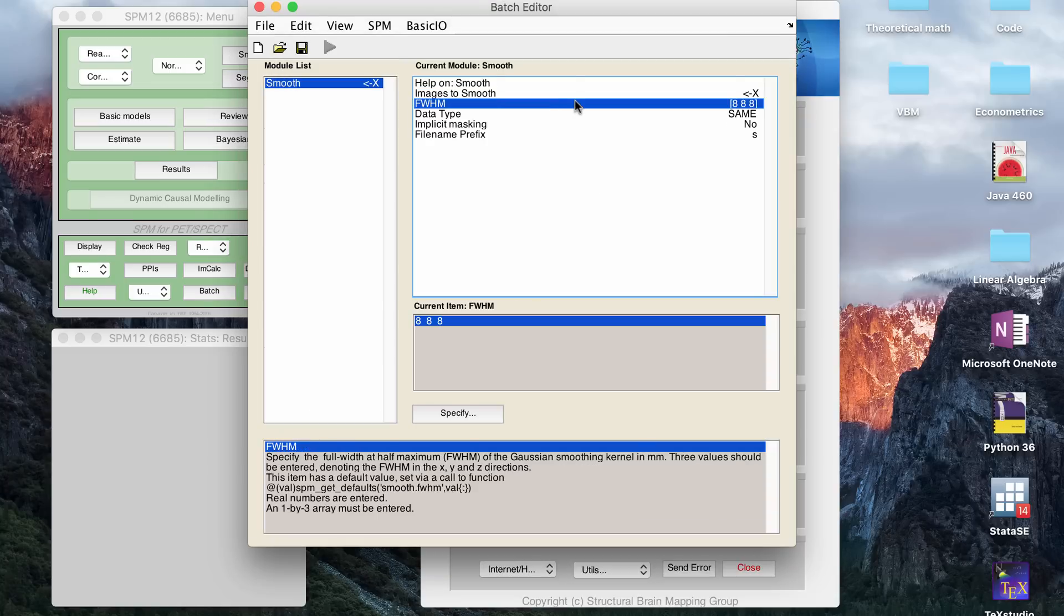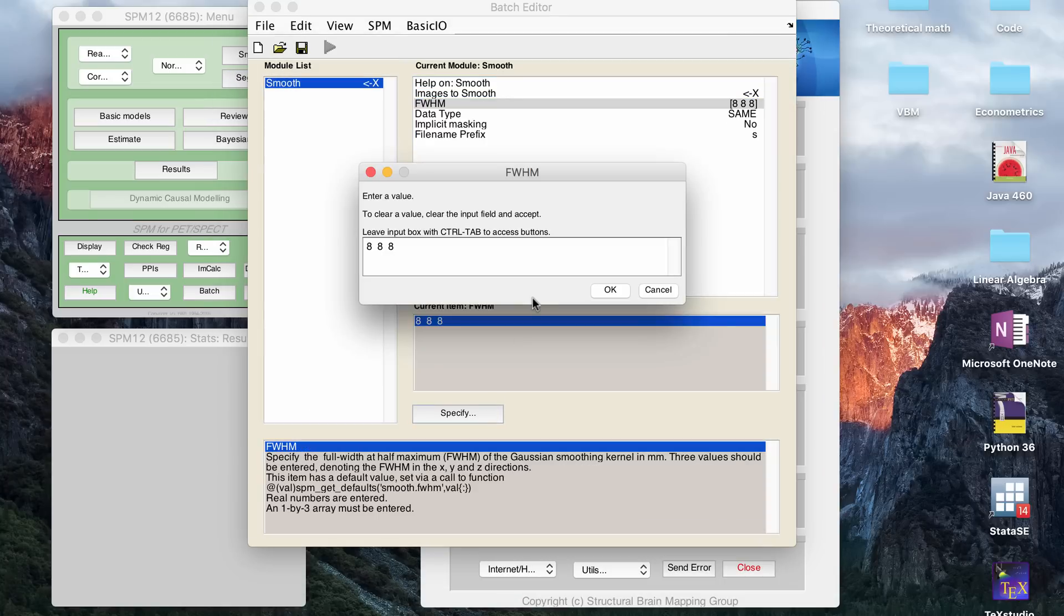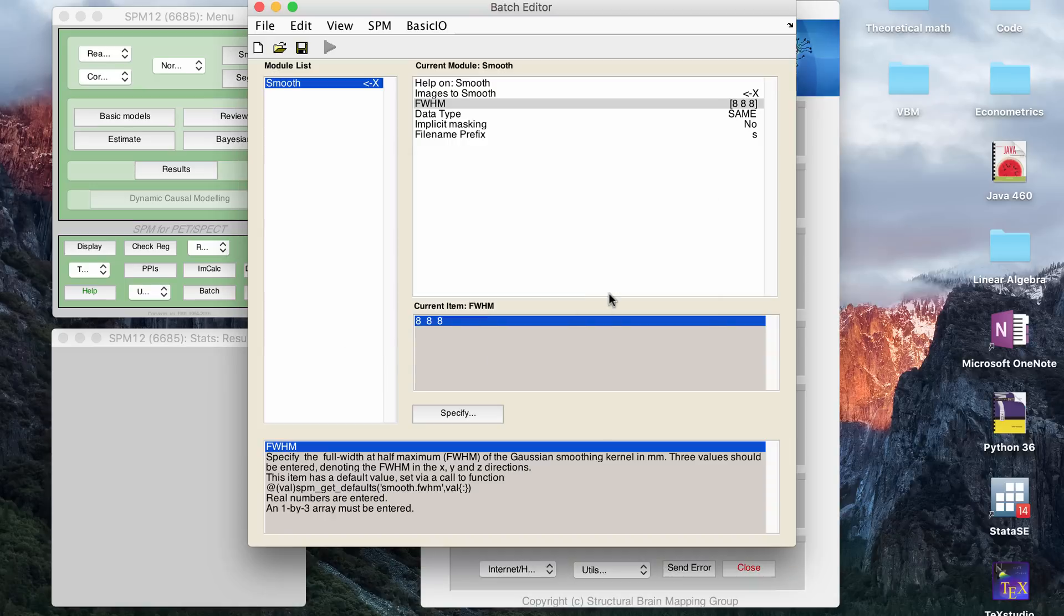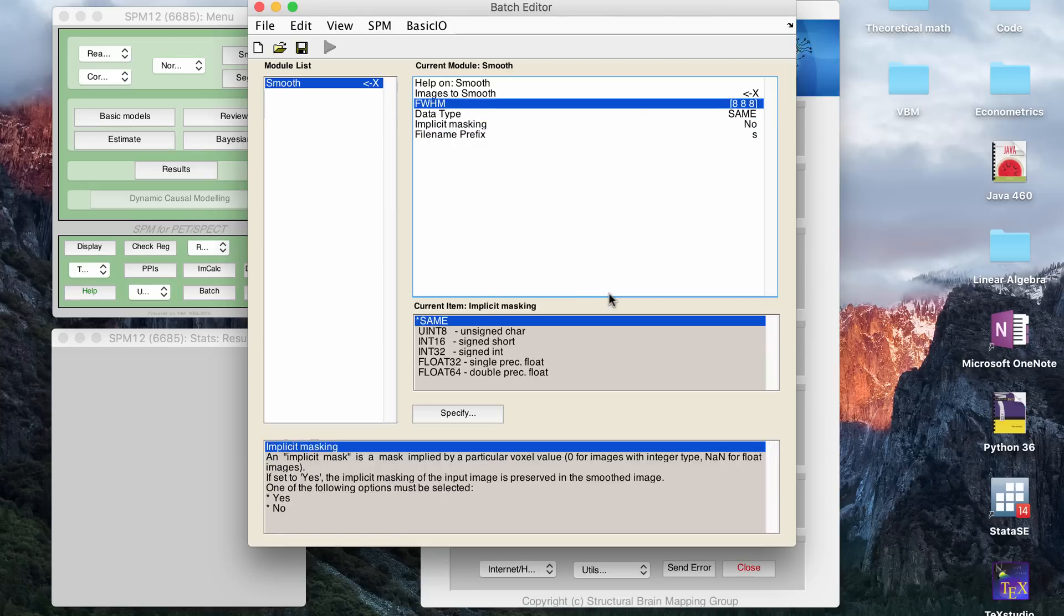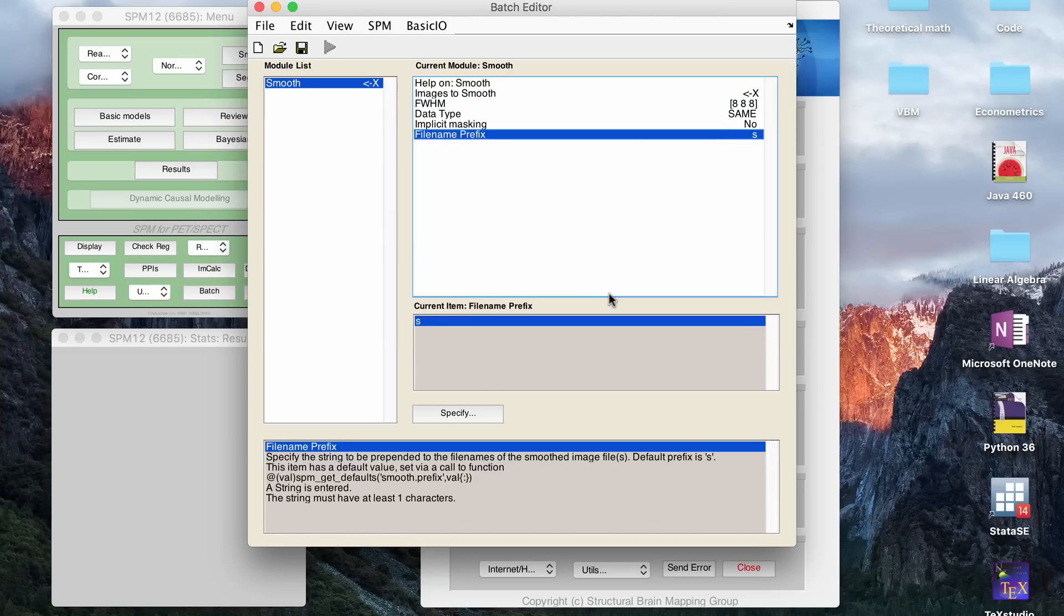And then for this, this is the smoothing kernel. So I think the CAT12 manual recommends anywhere between eight to twelve millimeter smoothing. I've tested it also with smaller kernels, so I've tested it with three for example, but you don't get better results just because you do less smoothing. Actually, I think it works best at about a kernel of eight. So I recommend doing eight as well. You have a lot of other options that you can change, but I usually just keep the defaults for a lot of these things.